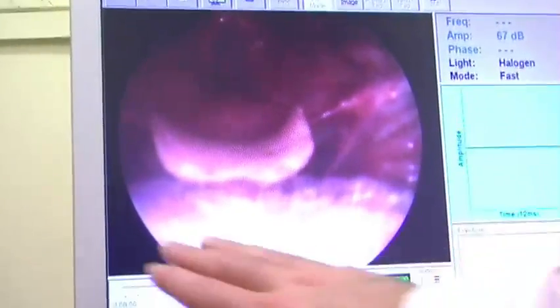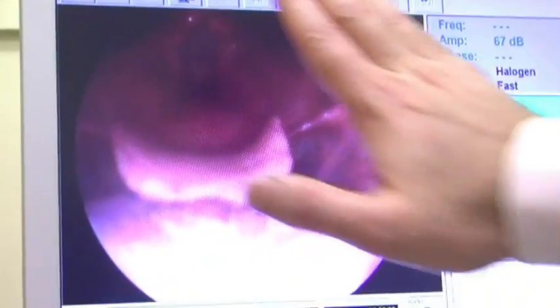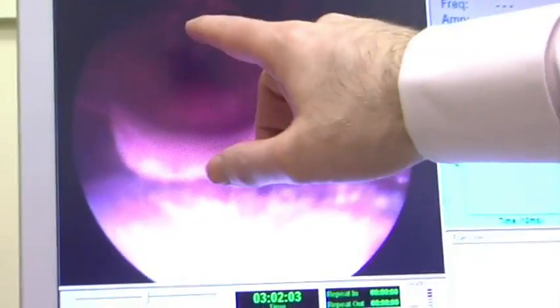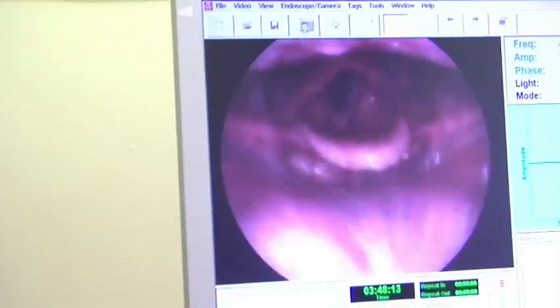So what we see here - this is the back of your tongue. This is your epiglottis, which actually protects the vocal folds when you swallow, but also is used in certain sounds, particularly in twang. And this whole structure in here is the larynx. What you're seeing here is basically the vocal folds closing and opening. Here's the vocal folds widely open, and we can actually see down the windpipe.